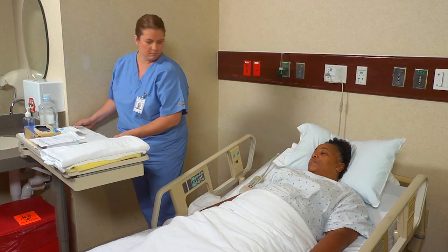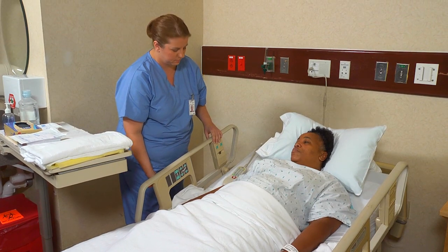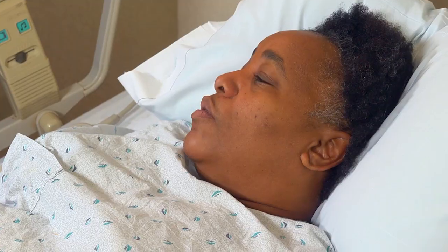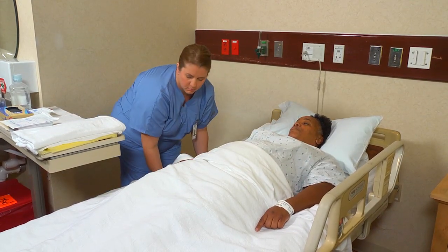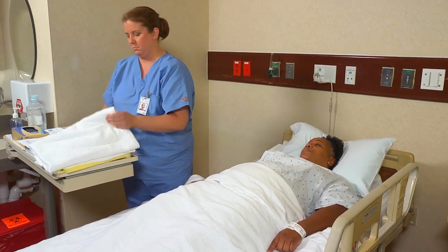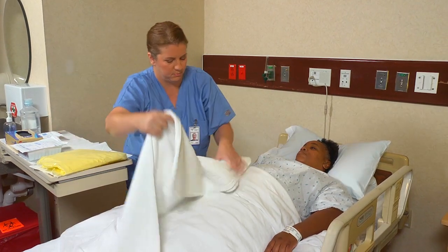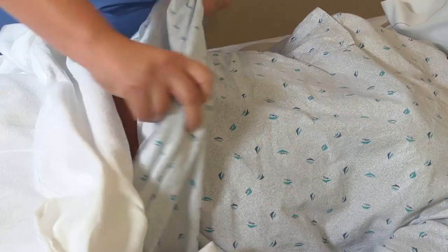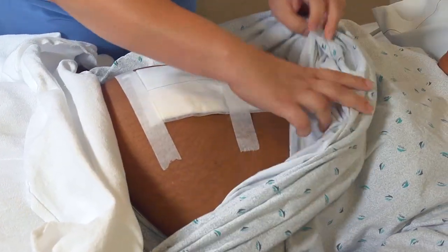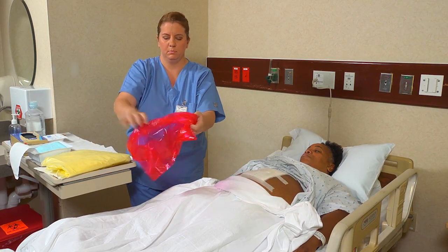To apply a dry, non-sterile dressing, first arrange your work area so you don't have to reach over it or turn your back on it. Then lower the bed rail near you if it's up and help the person into a comfortable position. Cover her with a bath blanket and fan-fold the top linens to the foot of the bed. Now expose the affected body part. Make a cuff on the plastic bag and place it within reach.